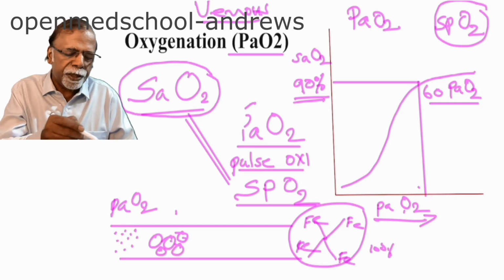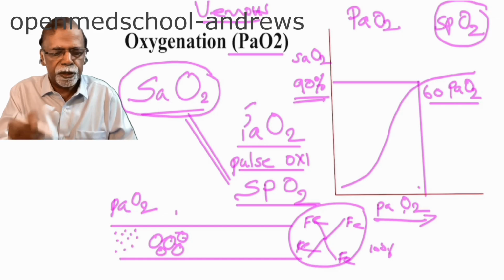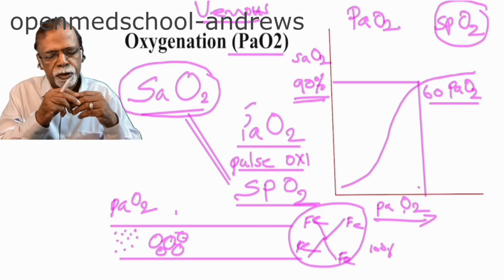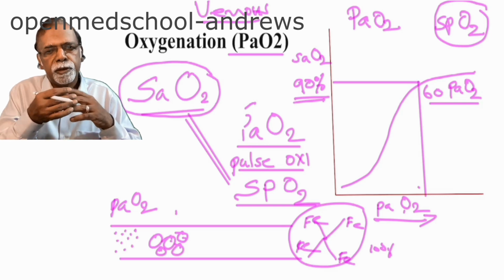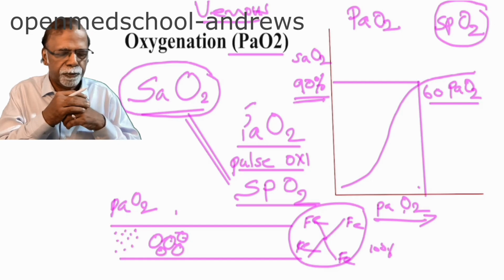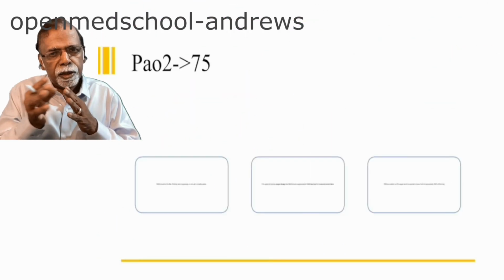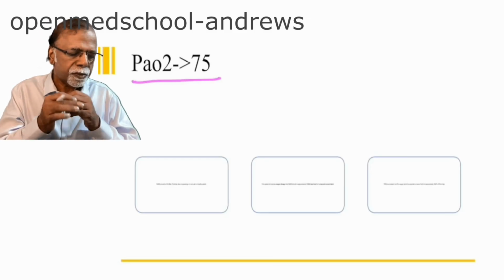In some conditions, there can be difference between the SpO₂ and SaO₂. That is saturation calculated using the ABG machine and the pulse oximeter. Typical example is the carboxyhemoglobin methemoglobinemia. So there can be a dissociation. It is called the saturation gap. The alveolar arterial gradient we will discuss in another session.